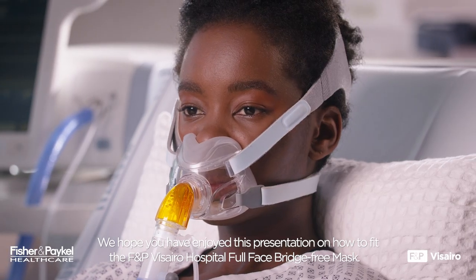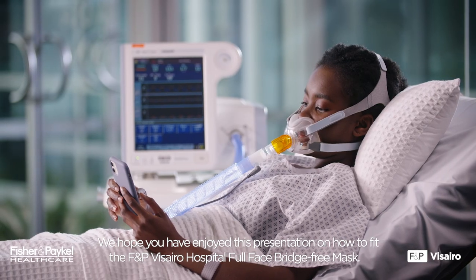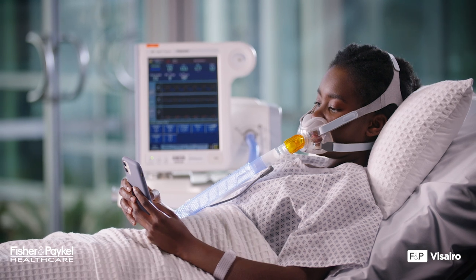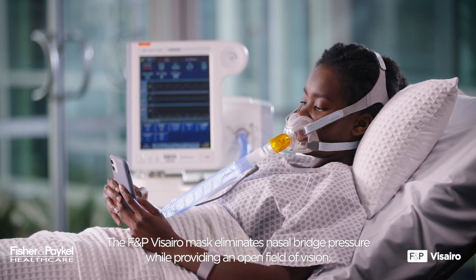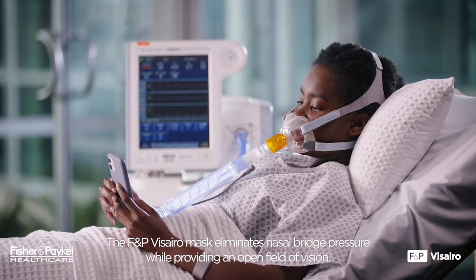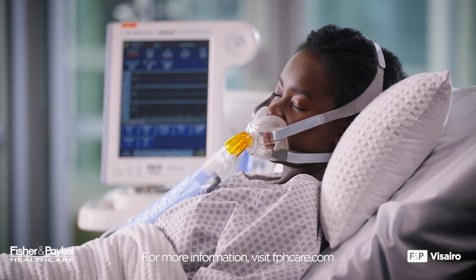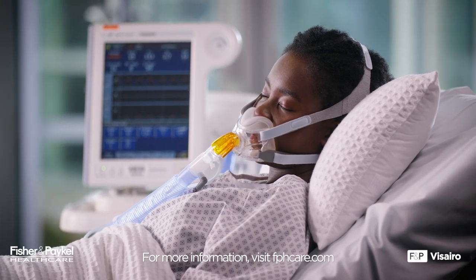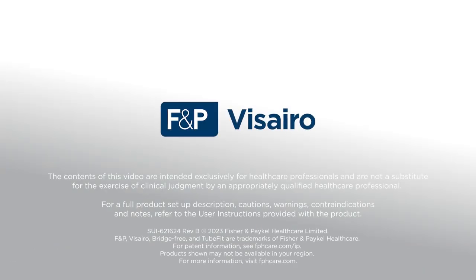We hope you have enjoyed this presentation on how to fit the F&P Visairo Hospital Full Face Bridge-Free Mask. The F&P Visairo Mask eliminates nasal bridge pressure while providing an open field of vision. For more information, please contact your local representative about these or any other Fisher & Paykel Healthcare products, or visit fphcare.com.